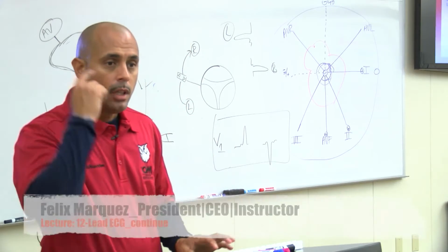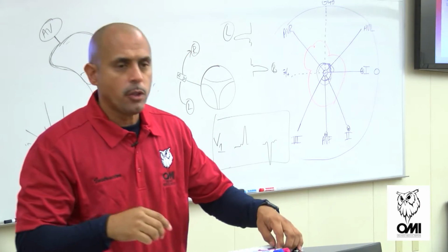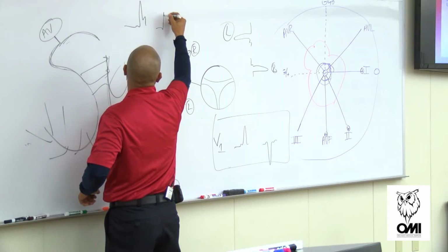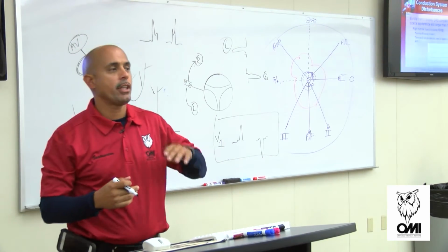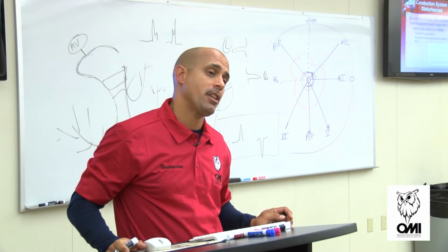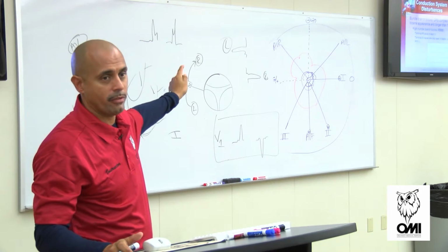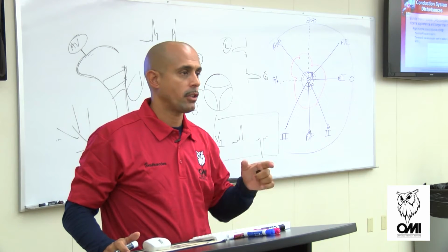All right, so now we can determine the slope. And you hear rabbit ears. What you hear is you're talking about something like that, right? Versus like that. They say if the ears are on the right side, it could be a right bundle branch, left side could be a left. But you can actually have ears and still have a tight QRS. So I want you to know right, complete, left, the way we just talked about. Lead 1, go to V1, upward, downward deflection.